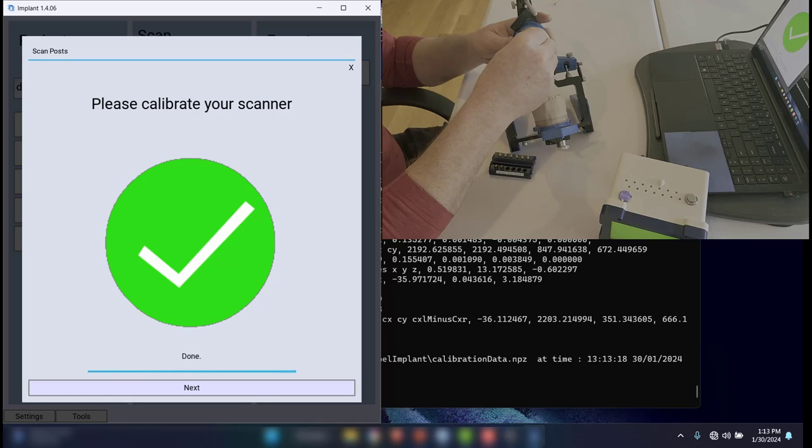So like with any kind of multi-component, you've got to get lined up right on that screw head, and then once it grabs, it goes in really easy. So the calibration is finished, as you see there. And I want to point one thing out to you here.